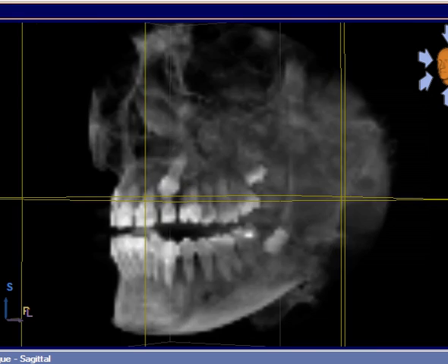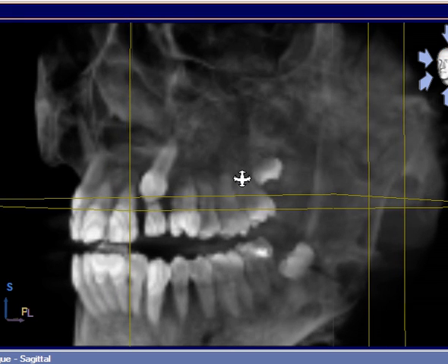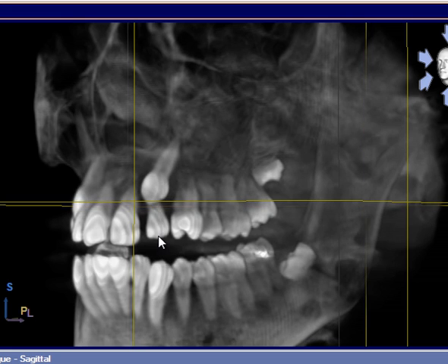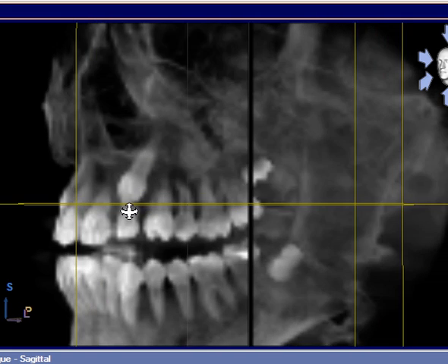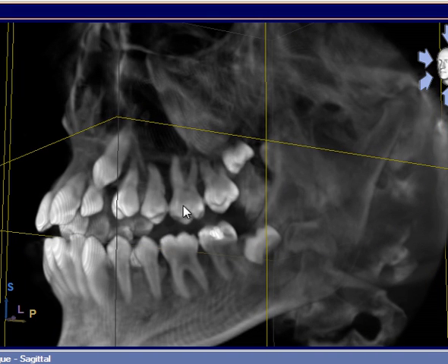I'm going to zoom in a little bit. And there it is, right there. You can see that this tooth should be positioned right here. And that's how this x-ray three-dimensional CT can help me with the diagnosis and treatment planning of my patients.